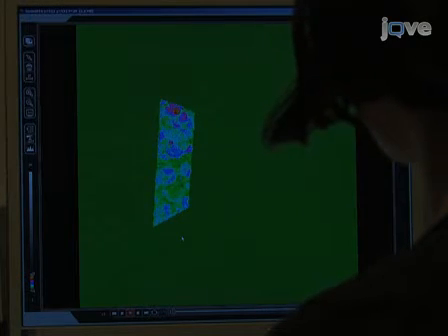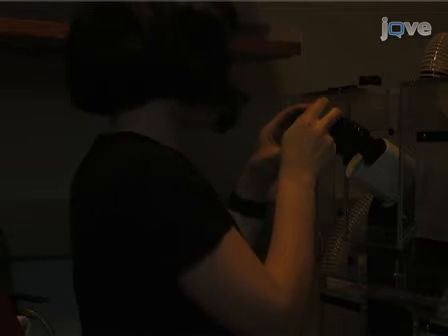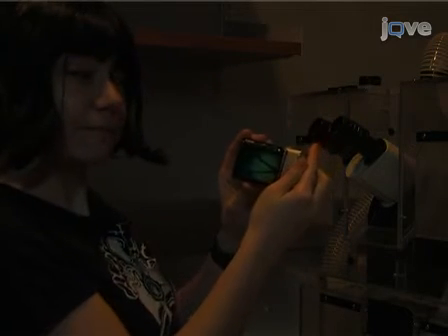To photoswitch more than one region in the tumour, take pictures through the oculars using a digital camera in both the green and red channels. This will help with orientation during subsequent imaging sessions.